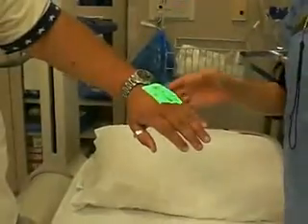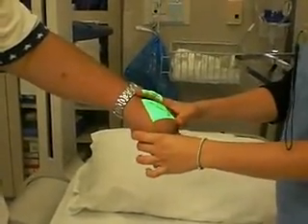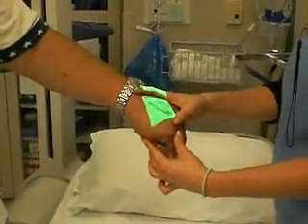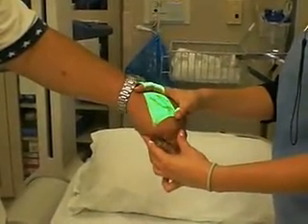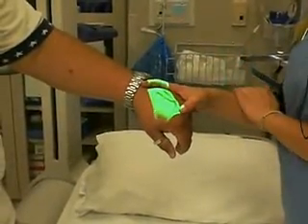This is 100% safe to use on kids. We can use this on any skin color, any disease state — from infants all the way up to adults. It's very popular in adults as well. Half the battle in starting an IV is actually finding where to go — it's not the cannulation itself, or putting the needle in.